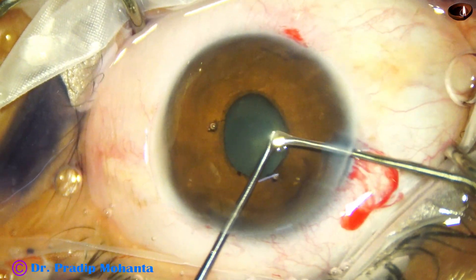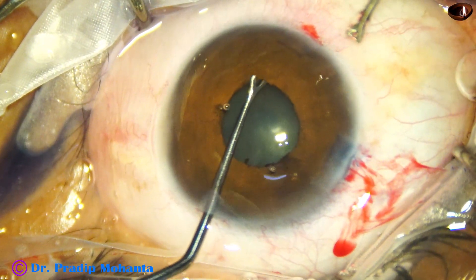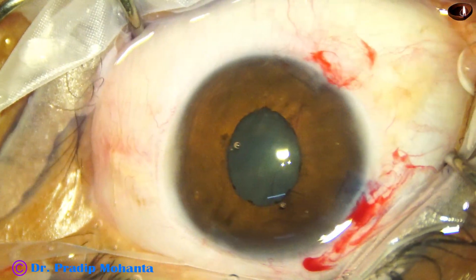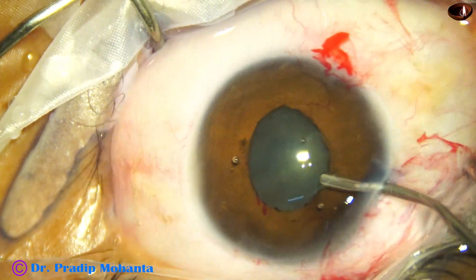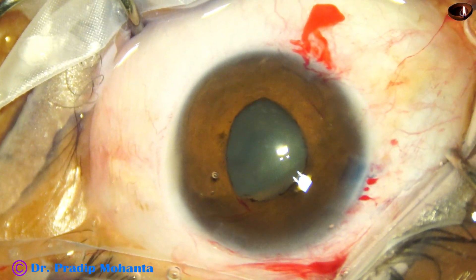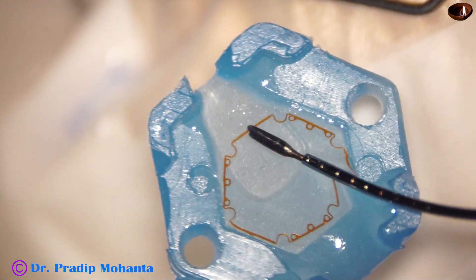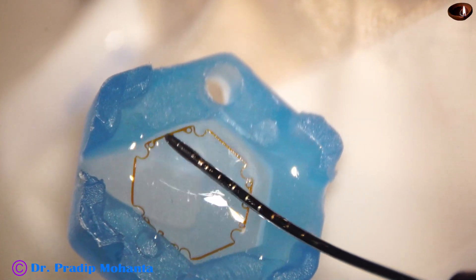Now, to use this device in this case, I am going to stretch the pupil using this OI hook. The prongs of this OI hook are blunt, so they will not cause any injury to the anterior capsule. Very mild stretch is used so that sphincter tear is not much. There is some stretch, but it will not cause a lot of tearing of the sphincter. Very mild stretch. This is the B-hex ring — a hexagonal device, very thin.